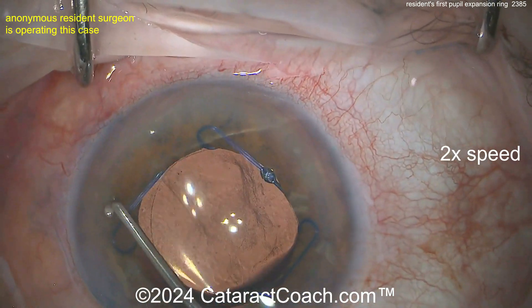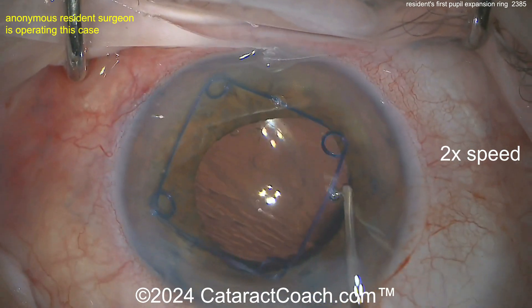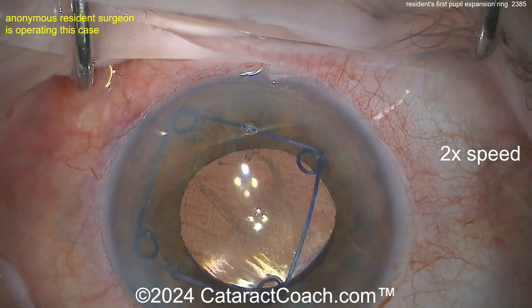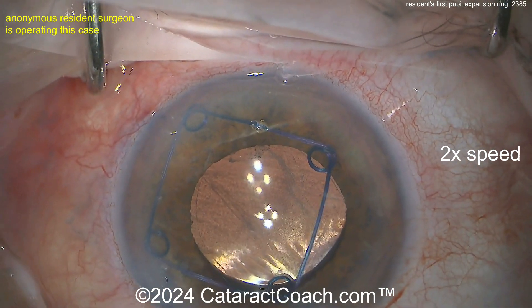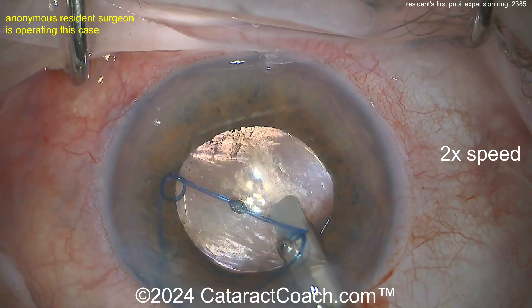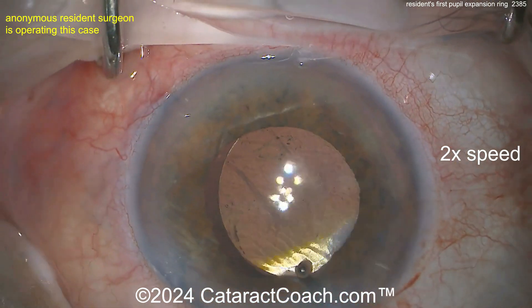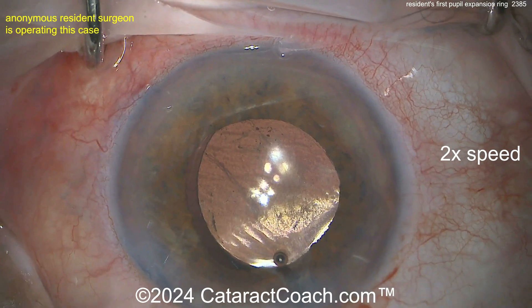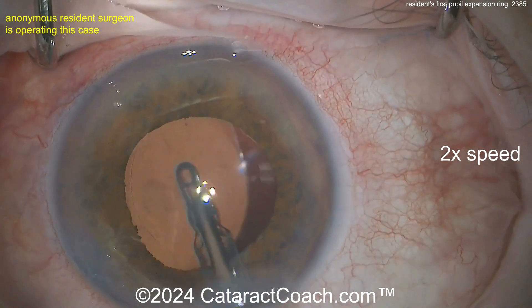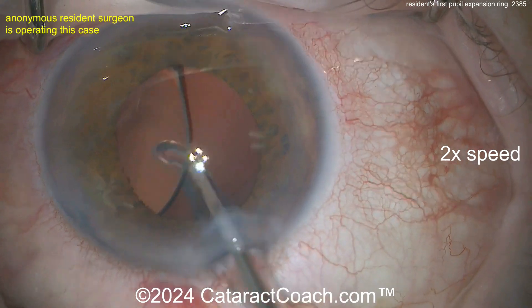Slowing the video down to 2x speed now — gently taking those scrolls off of the pupil margin, nicely done. Leave that ring in the anterior chamber, then go in with the injector; you can grab onto it anywhere. Grabbing it right there, then just withdraw it and it goes back into the injector. These are single use so you can just throw it away. Very nicely done. Remove the ring from the eye while the anterior chamber is still full of viscoelastic — it makes life much easier.